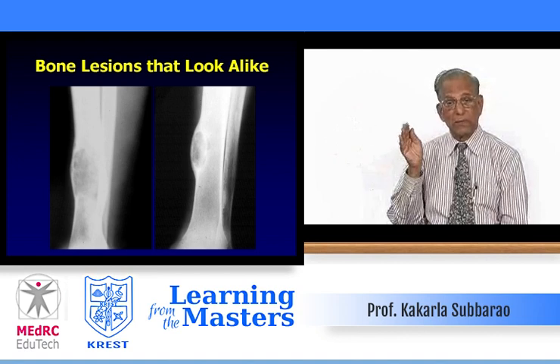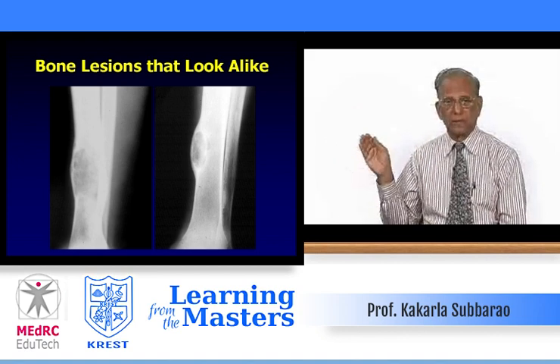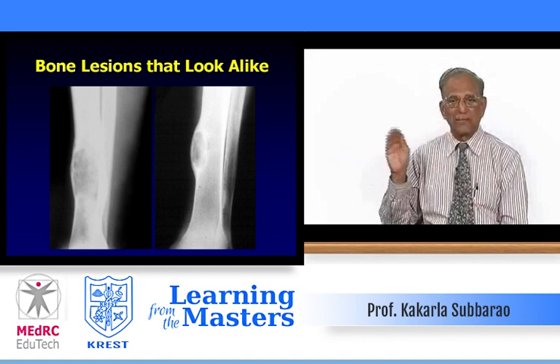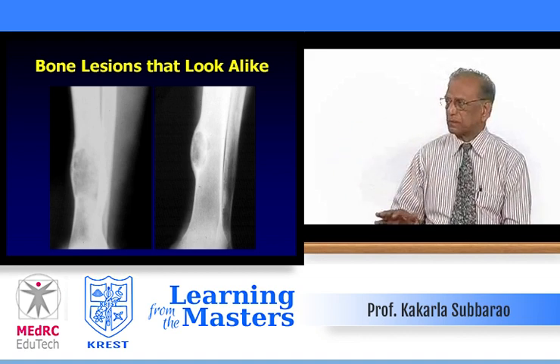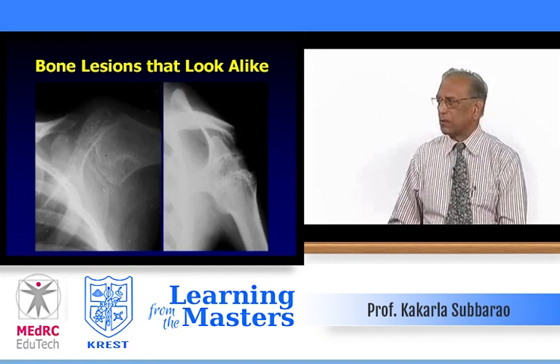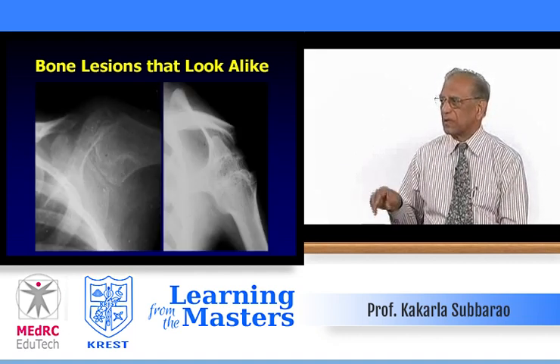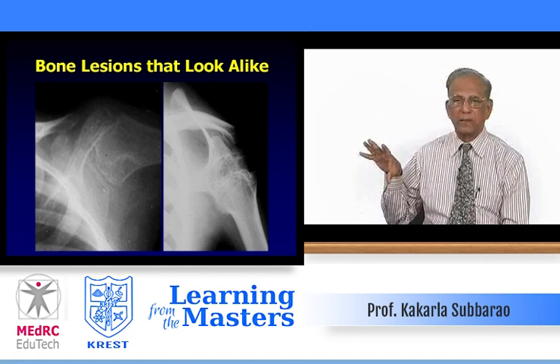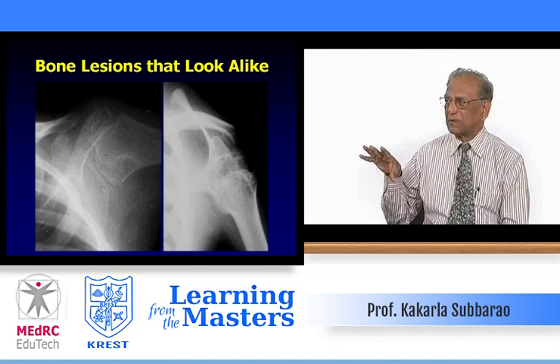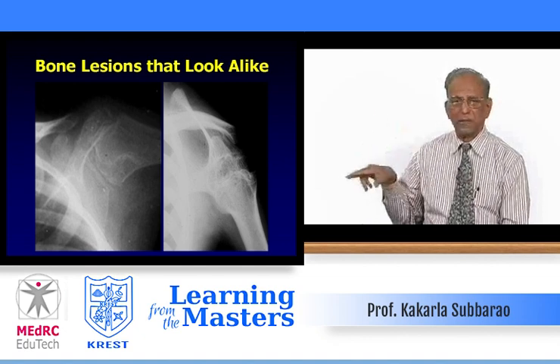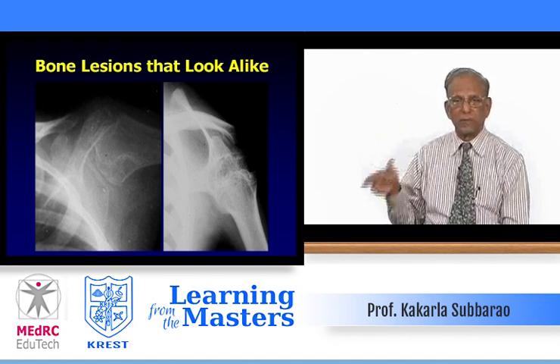A child with marked trabeculation in the proximal metaphysis extending to the epiphysis. This is a simple cyst with multiple trabeculae. We cannot call it a giant cell tumor because the epiphyseal plate is still intact, though rarely it may cross. As said earlier, giant cell tumor can cross the joint. On the right side, an aggressive expanding lytic lesion with trabeculation and a wide zone of transition — this is again a desmoplastic fibroma.